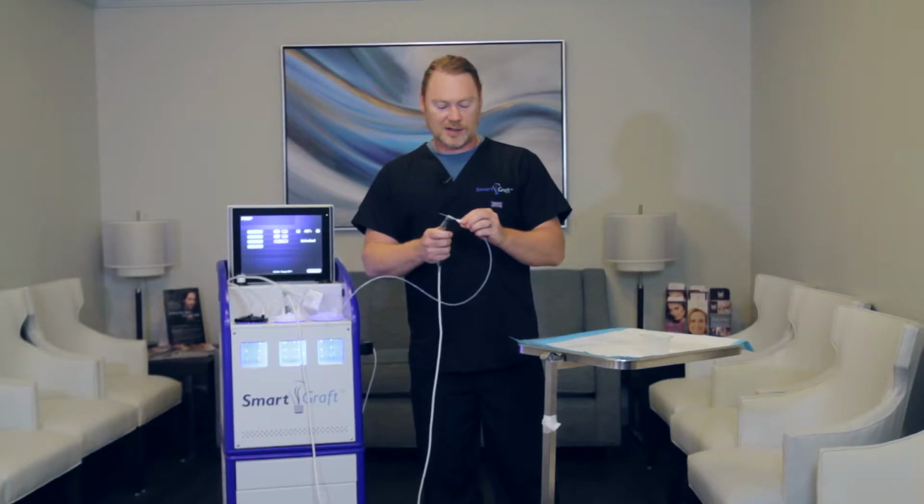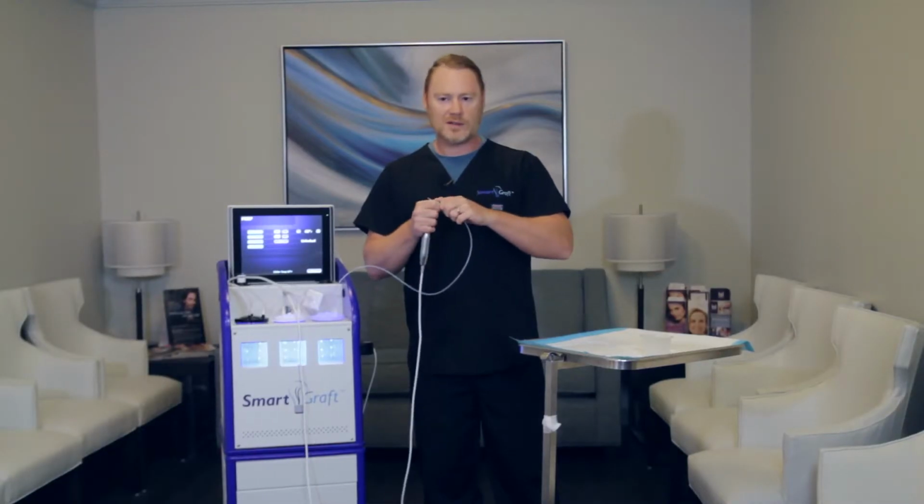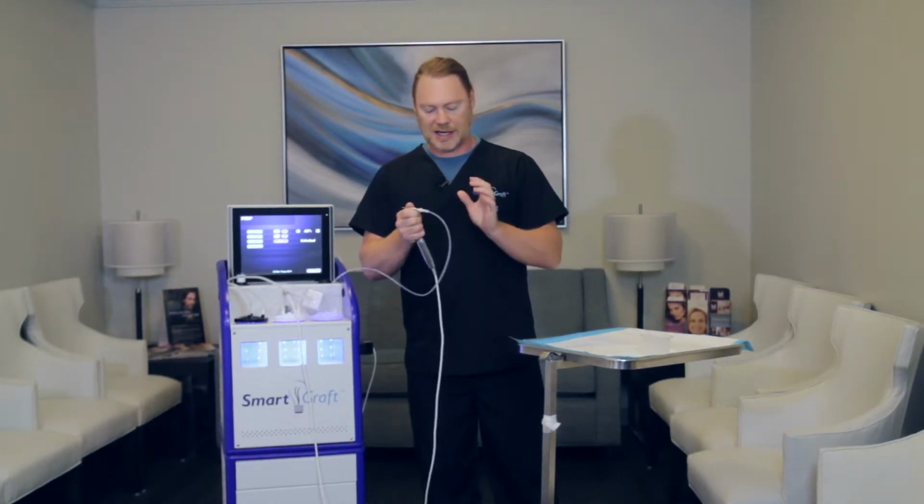And this will actually just connect right onto the back end of it, and it is actually secure. If you want to take this off, you'll just have to pull it right off, but it actually does create a suction that holds it in place.